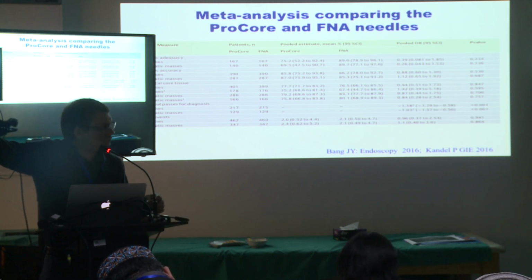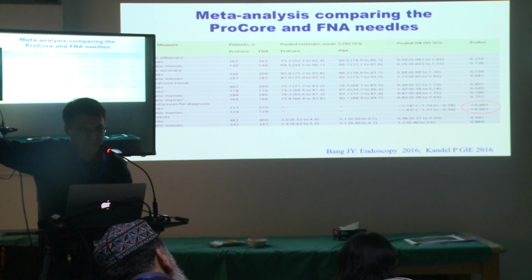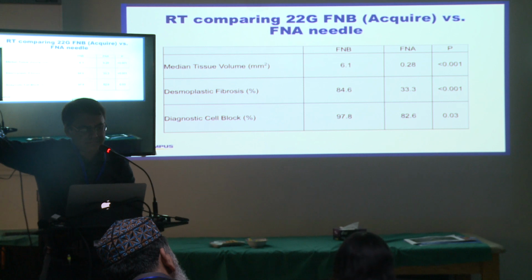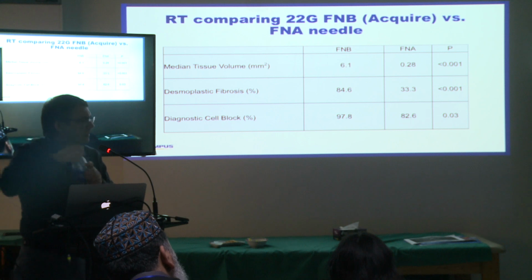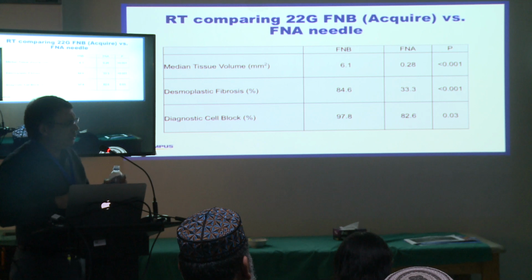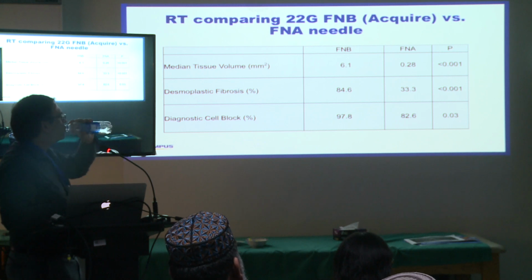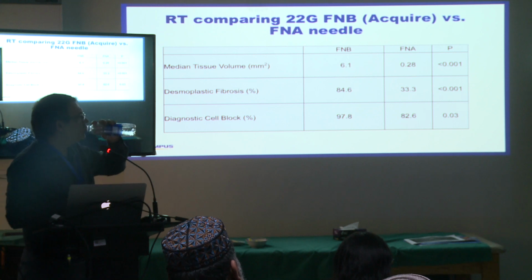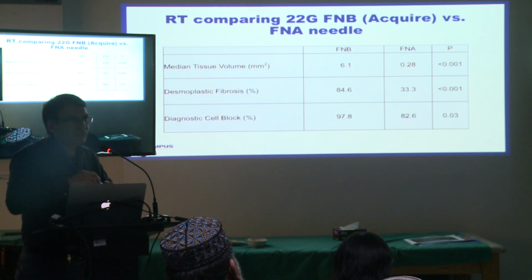Okay. Anecdotally, I would say that there probably is a bit more pancreatitis. We always used to quote less than 1%, but I have certainly seen that now I say 1 to 2%. I think there is, but if I'm doing biopsies for autoimmune pancreatitis, when was the last time you did it for autoimmune, and how many did you do in the last 2 years? No, less than fingers on one hand. But it'll generally be 25 gauge, 4 biopsies. Yeah.